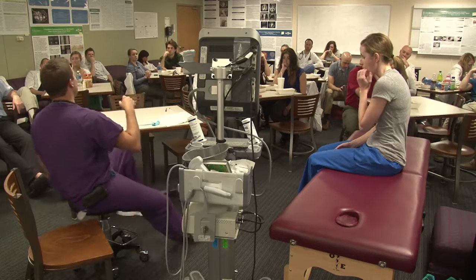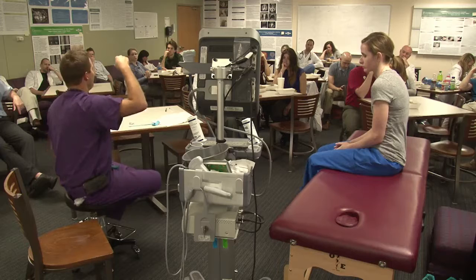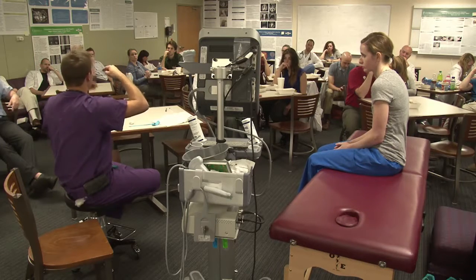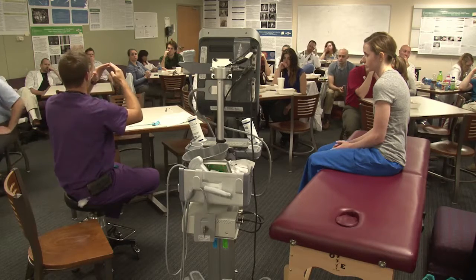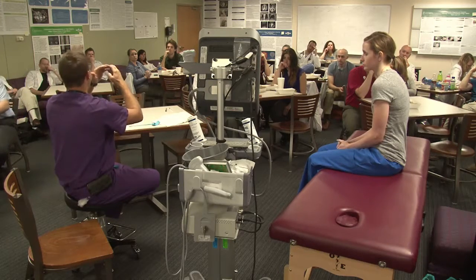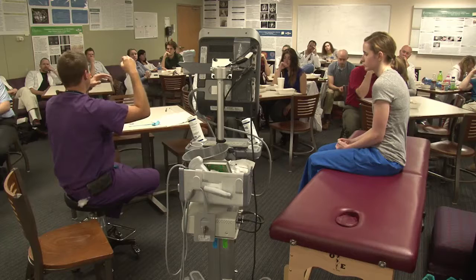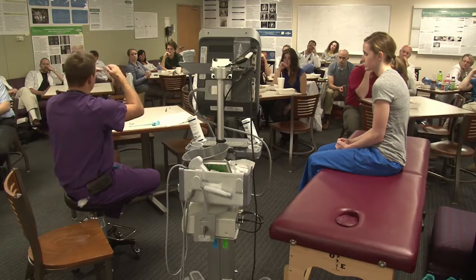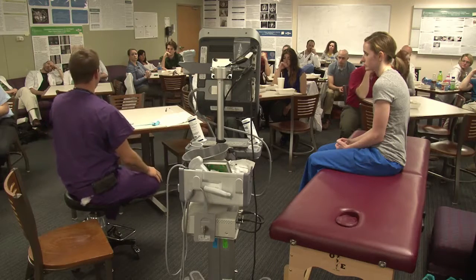So one way that you can actually help see the tip of the needle in a short axis view is when you're bringing it in, if you're able to see the wall of the vessel depress, okay, that means I'm close to the tip of the needle. So if you bring it in and you're tapping it around, you can see the actual upper wall of the vessel compressing and pushing down.